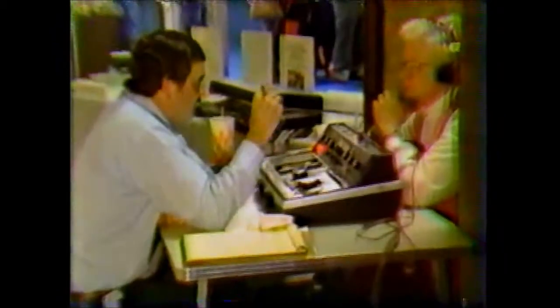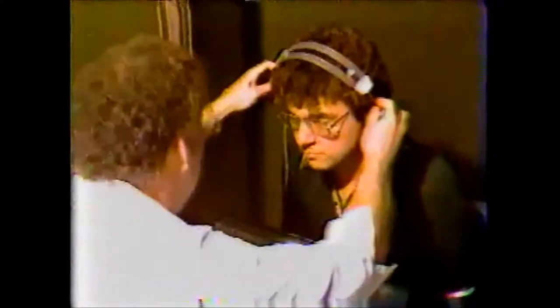Well, it was good to hear that my mouth was okay, and speaking of hearing, that seemed the next logical thing to have checked. And Bell-Tone hearing aid specialist Ron Braswell conducted the test for me. We'll put these earphones on your ears, and you're going to hear some little beeps. I want you to acknowledge by nodding your head when you hear the beep. All right, we'll do your right ear first, then your left ear, but I'll tell you when I'm going to switch.